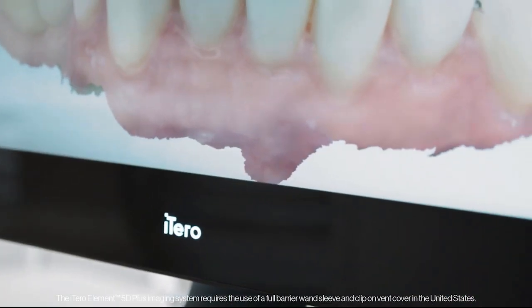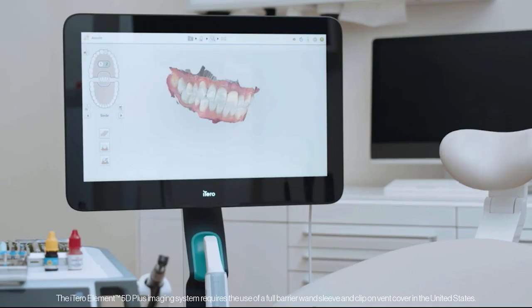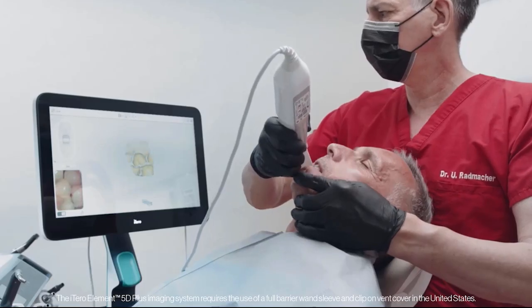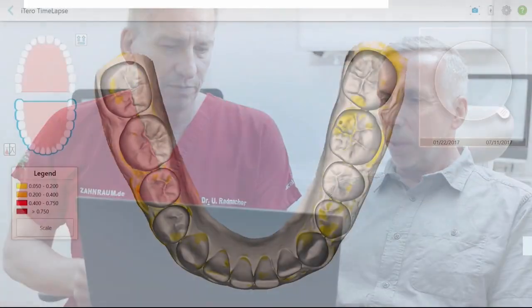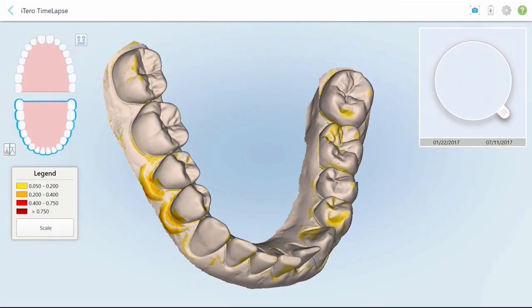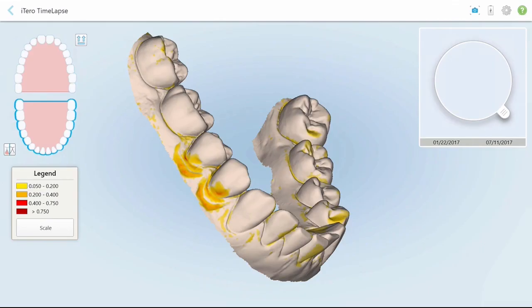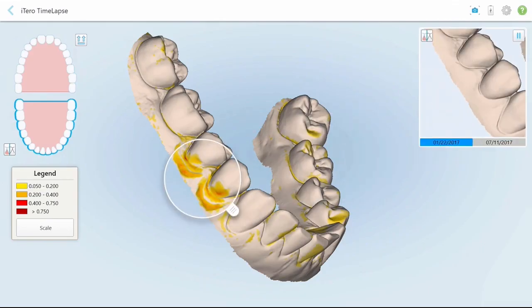The iTero time-lapse technology is a multi-faceted tool that superimposes and compares patient scans from two points in time. It serves doctors in visualizing tooth or soft tissue conditions and visually educates patients on their progress. Differences between scans are highlighted with a color map that can be scaled to different needs.